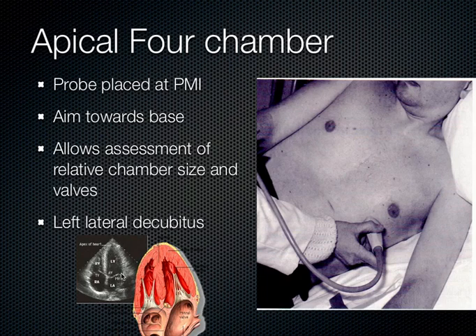And that's normal. As the right ventricle gets bigger and bigger, there could be some problems with the right ventricle trying to pump blood against an obstruction like a pulmonary embolism. And so in the setting of massive pulmonary embolism, or blood clot in the lung, the right ventricle gets so big it approximates the size of the left ventricle. So that's how I use this view clinically.